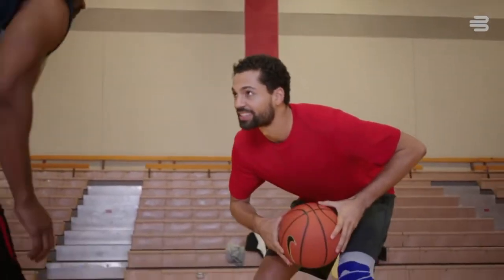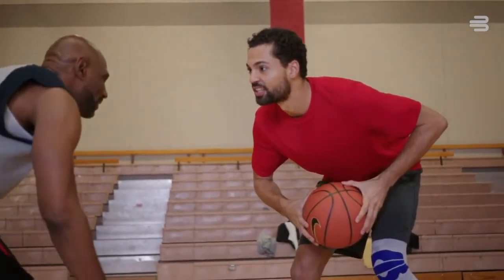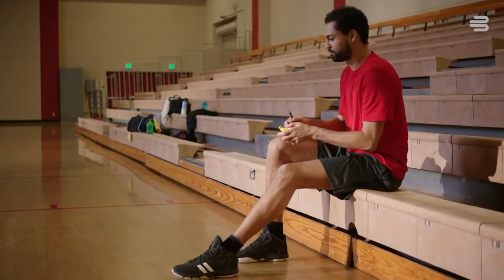Basketball has been a part of my life since I'm 12 years old. My Genitrain Knee Brace provides the support I need to keep going strong.